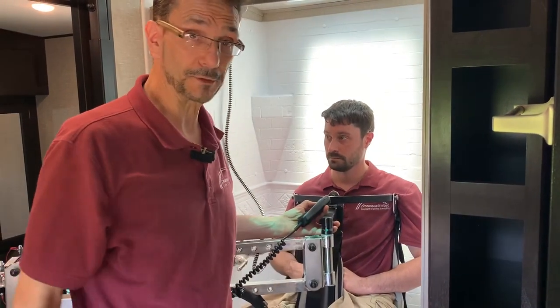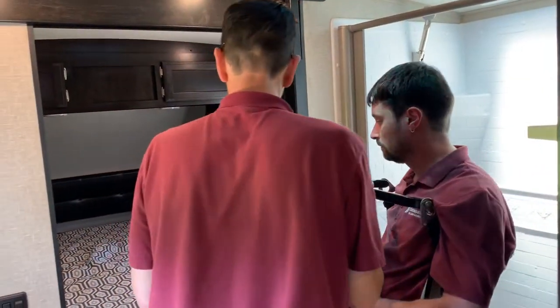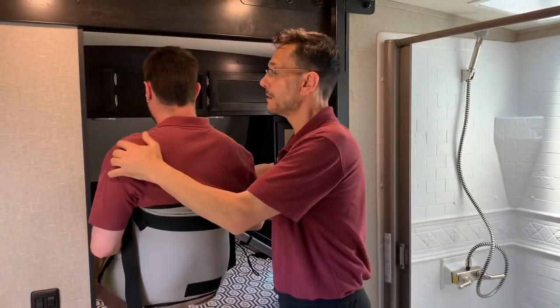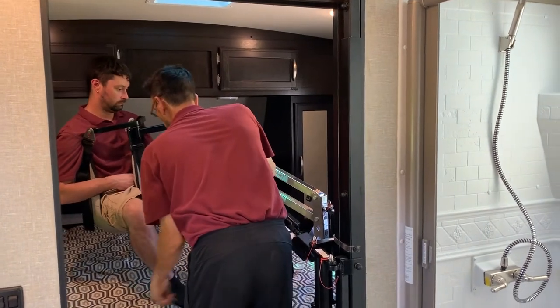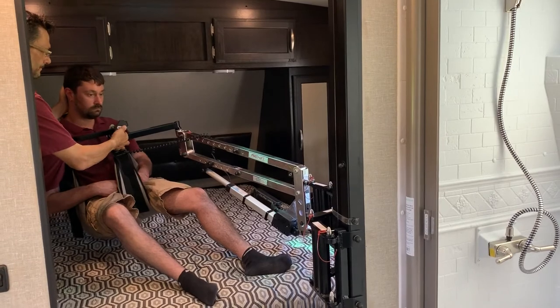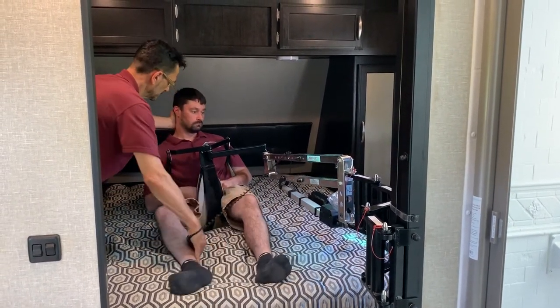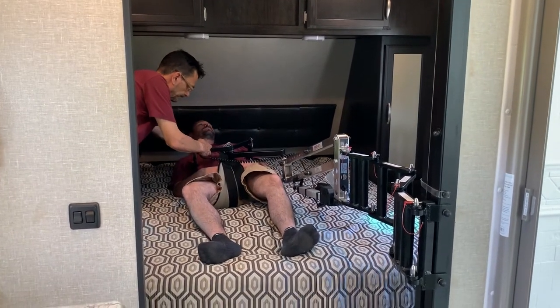Next stop is going to be the bedroom. Around the corner we go. You can see we get lots of elevation here — raise, spin around, and when we get all the way over we lower down.